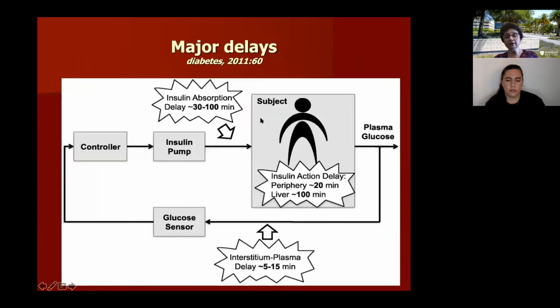And again, we talked about the delays. Unfortunately, with just giving insulin alone in the subcutaneous tissue, we are not able to target all of those. There are other hormones that are produced by the pancreas. So that's why you don't necessarily aim for 130, 140 after the meal spike.